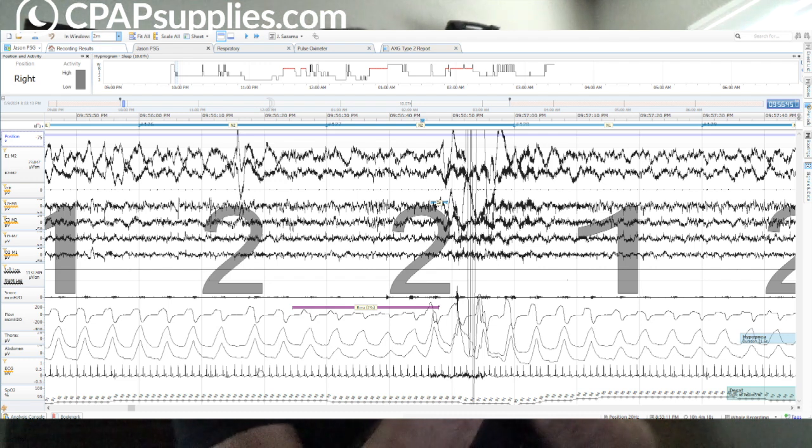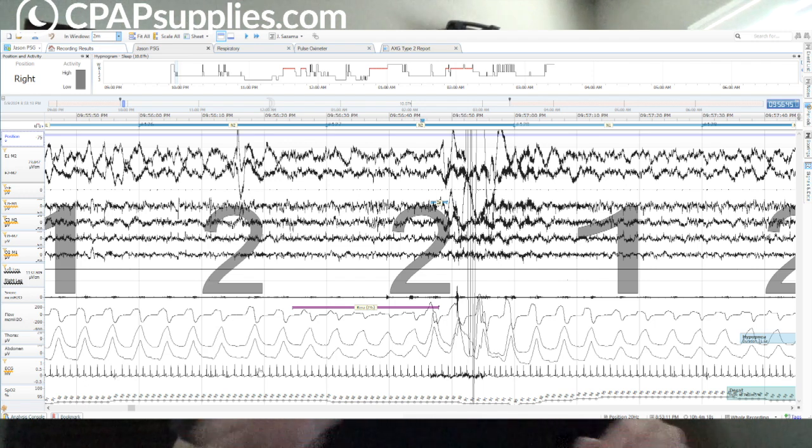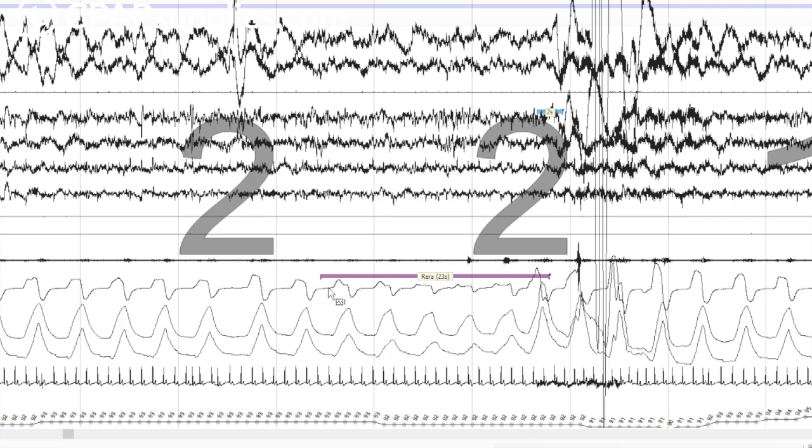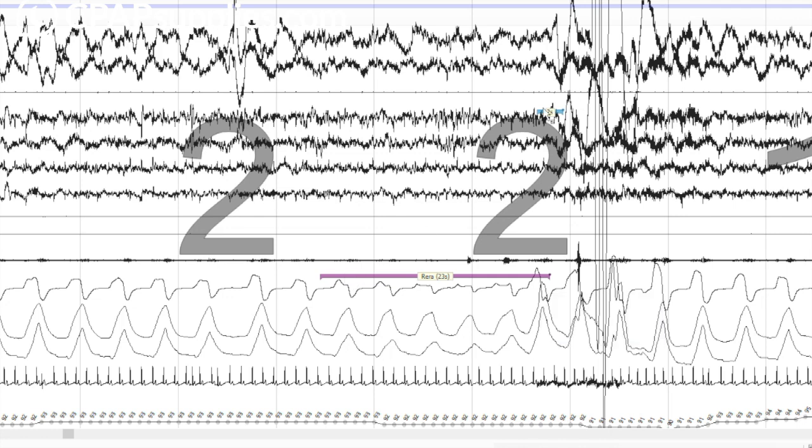Those ring things, the WellU rings are fricking worthless, by the way. And here's why. You can have periods where there's awakenings from sleep disorder breathing events, but there's really no blood oxygen desaturation to speak of. This is one of them. We have a drop from 93% down to 90%. It's really 91%. And we have decrease in airflow. You can see the really flattening on the tops of these, gasping awake. You see the shift in EEG, definitely awake.